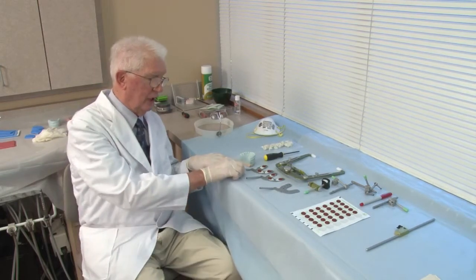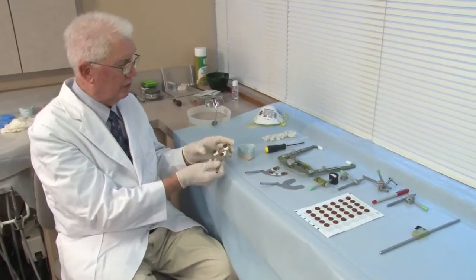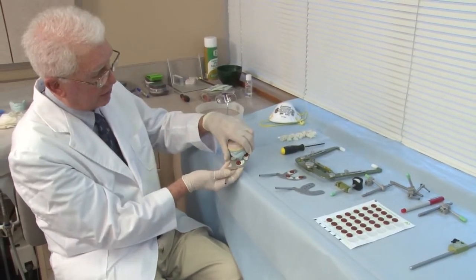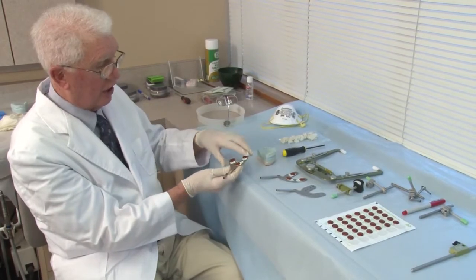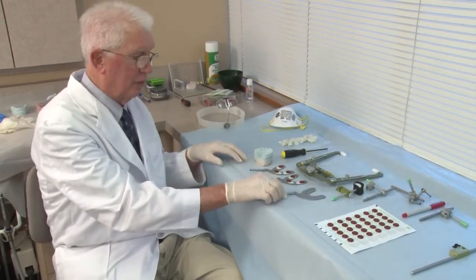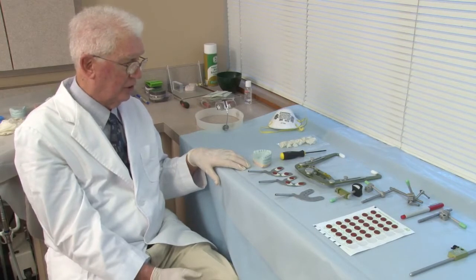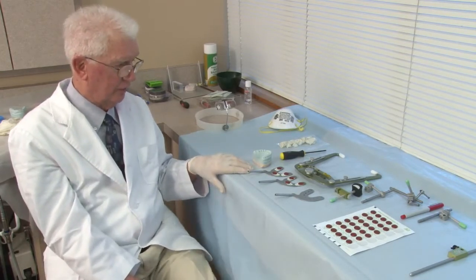For example, in doing the bite fork and placing the AccuBites, I have used a model to determine exactly where I want to place the bite tabs, and that makes it go much faster. I will do this one so that it'll be on the camera, but I've prepared 3 bite forks because we're going to be doing 3 different procedures here on this patient. And so having models ahead of time makes things go much faster.